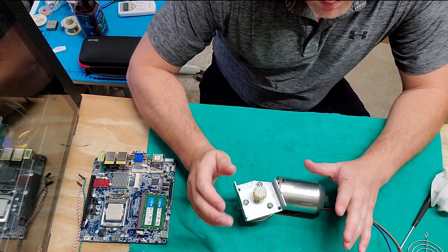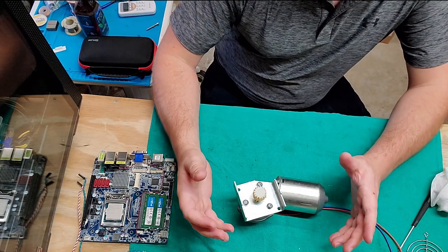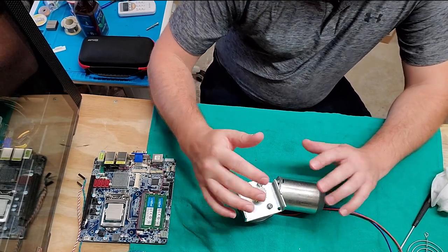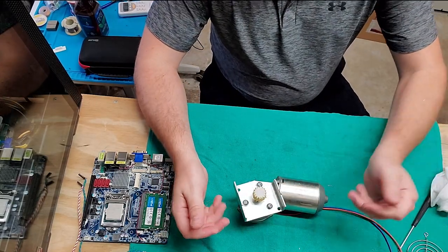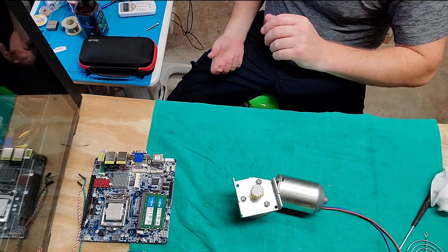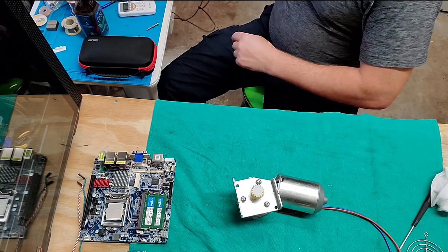They do that on purpose, so in case this guy crashes, instead of tearing metal, it's just going to strip the gear, and it pretty much preserves thousands of dollars worth of linkage instead of just a 30-cent gear. A lot of people complain, why would you put a nylon gear on a power transmission? But they do that intentionally so that it doesn't break.